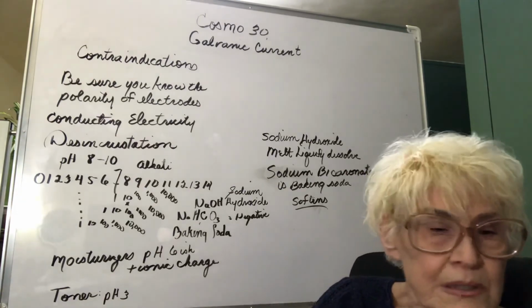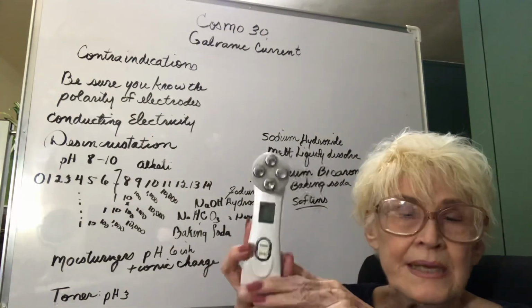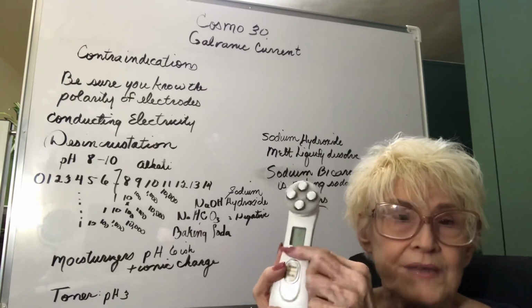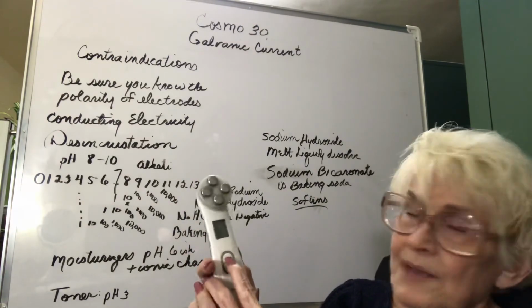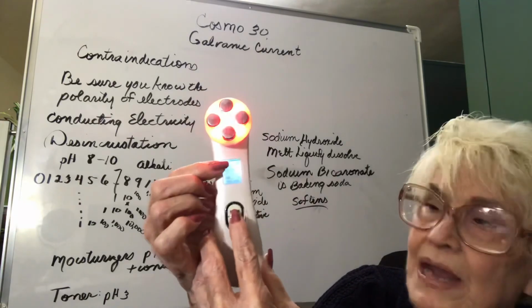The other tool that you can use at home, that you can give her at home, is a handheld. Anytime you see the 4 magnets, you know you have galvanic current going on. Okay, so when you turn this machine on, it's also one of the dermal lights. I push the top button, is right in here, and it controls the amount of electrical current.